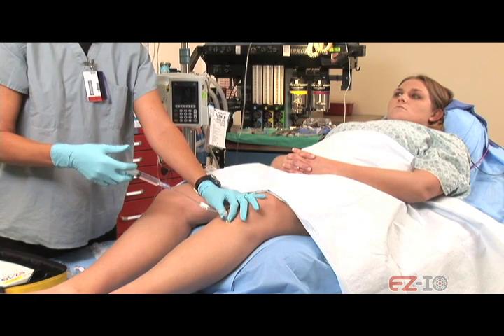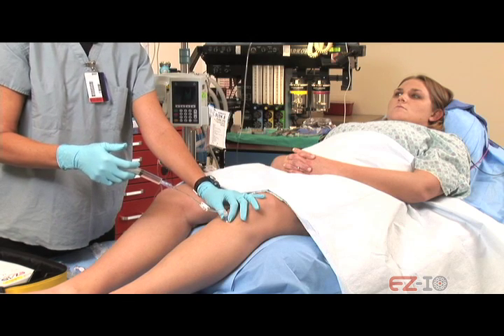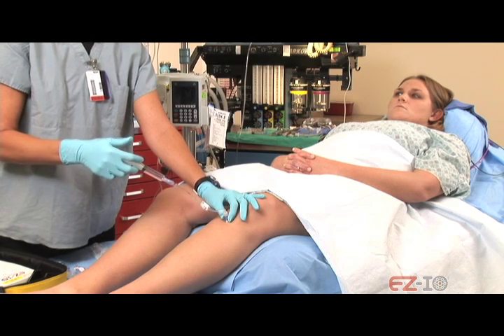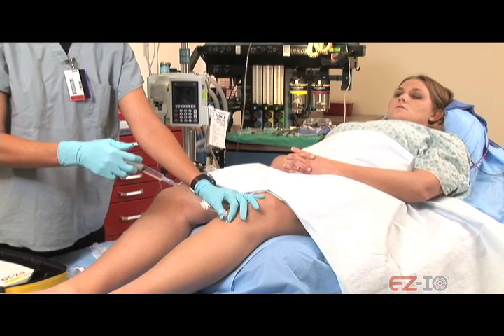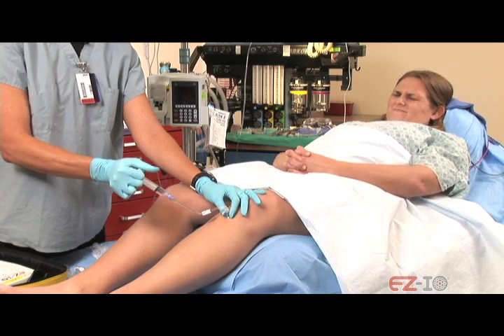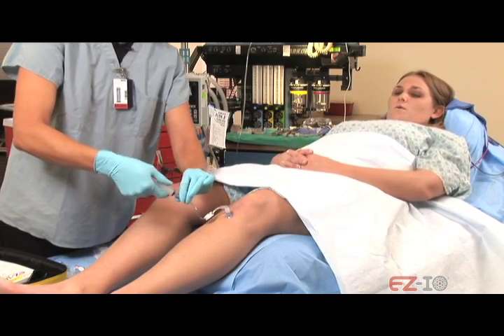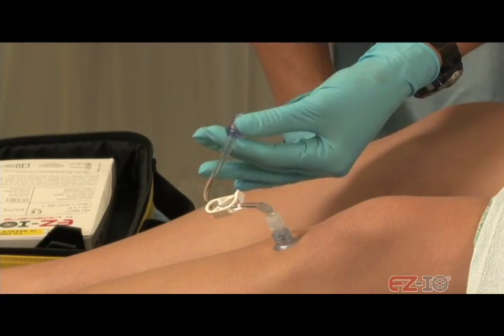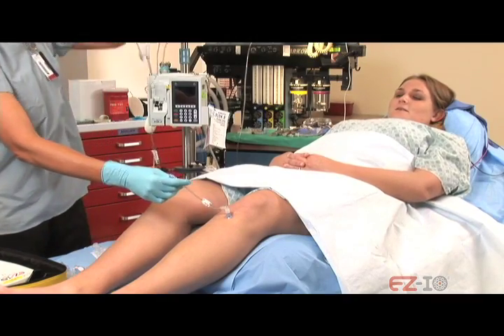Okay, it's going to take me about 5 seconds. So I'm just going to count down with you. You're going to feel some pressure and some stinging pain when I do that. And then I'm going to be done in 5 seconds, okay? Are you ready? Yes. Okay. 1, 2, 3, 4, 5. Okay? All right. What's your pain level right now? Like a 4. Okay.